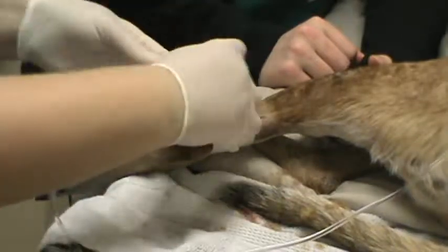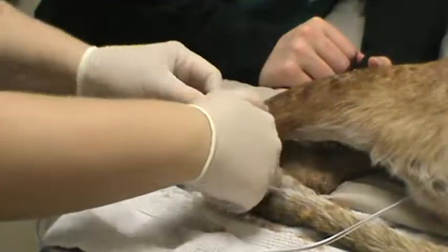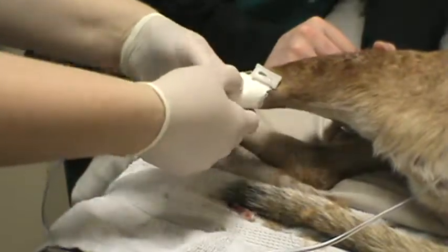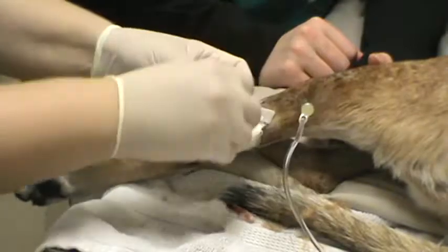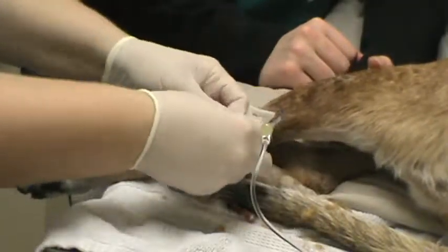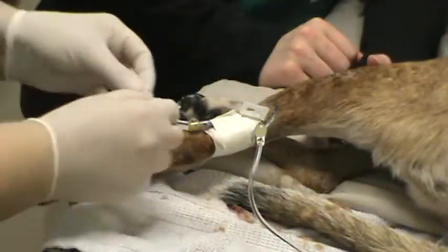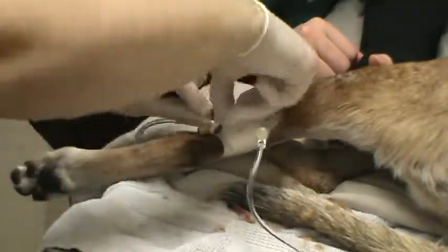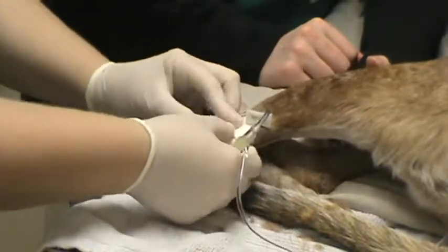Okay. We have a T-port attached here so we can give her induction drug. A little loop there. And a little courtesy tab for the person removing that. And since we don't use luer locks, we're going to have a little. Exactly. And now we're in place.